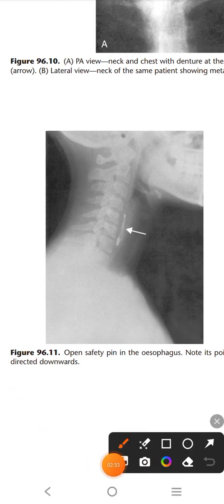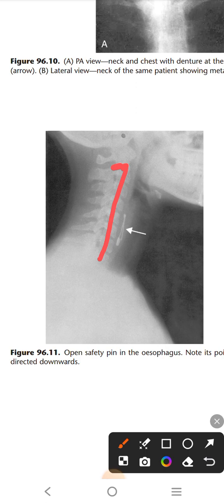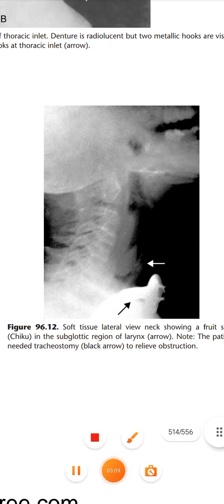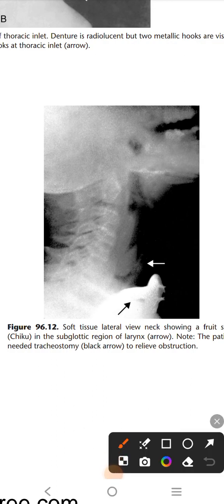You can read the vertebrae from below upwards to make it easier. In front of the vertebrae is the esophagus, and there is the trachea shown in black. Here you can see a lateral view of the neck with a foreign body — a safety pin — shown in the esophagus. This safety pin is directed downward and is open. The arrows always indicate any abnormality; here the esophagus is indicated, and above it is the airway with a foreign body in the airway.